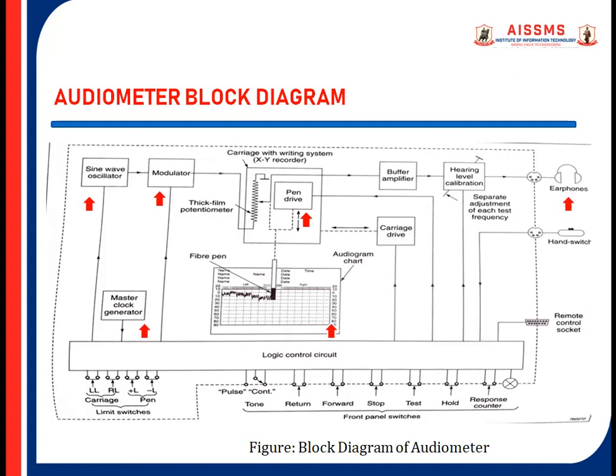The instrument generates a pure tone signal which is presented to a patient through an air conduction earphone. The subject is told to press a switch when the tone is heard and to release the switch when it is not heard. The switch controls the motor-driven attenuator of the audiometer.